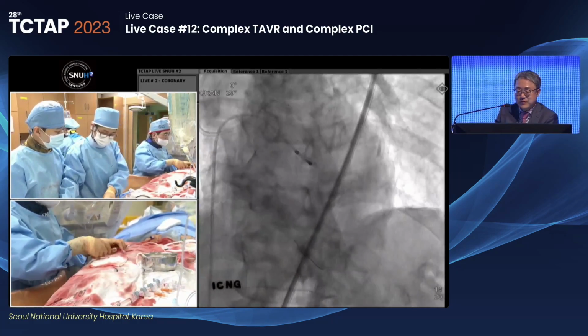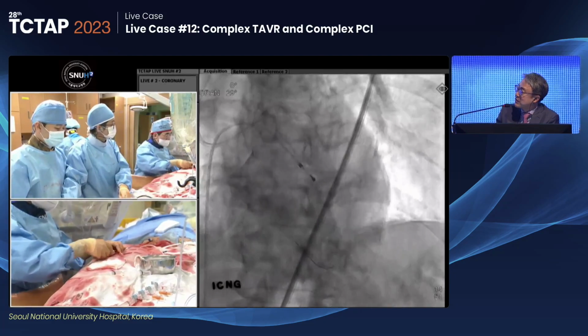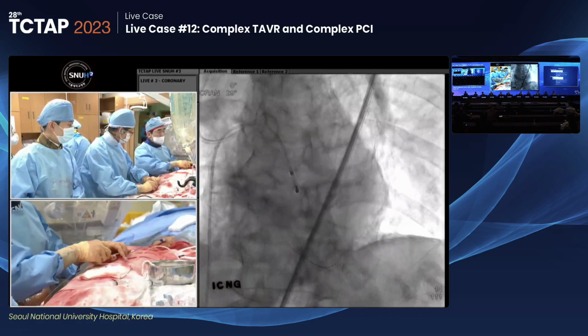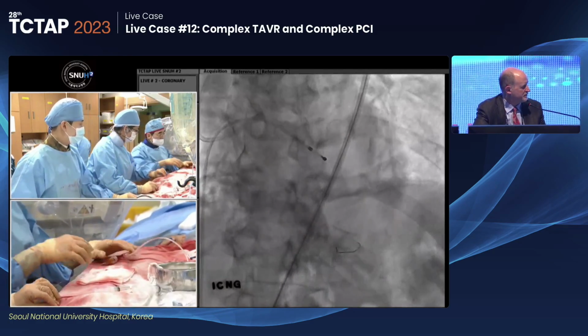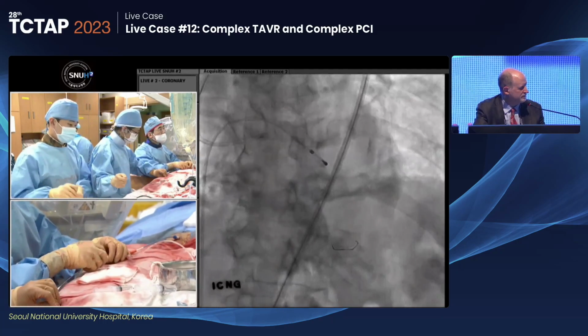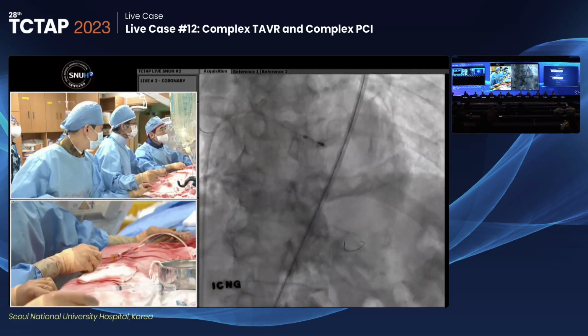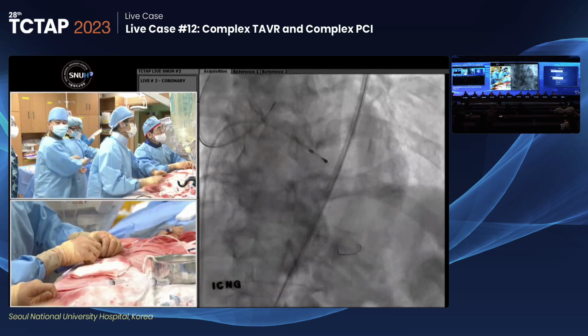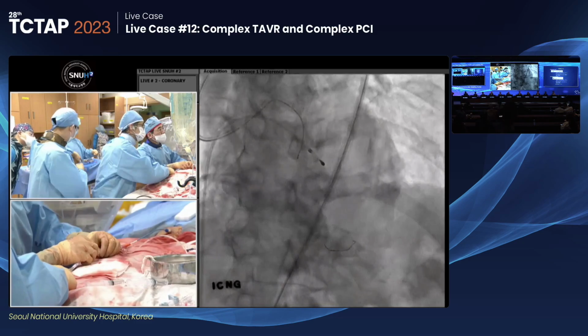It still won't go down. Shockwave is a little more difficult to deliver than an NC balloon. It delivers okay, but it's a little tougher than even an NC, and it doesn't come this small. That is not the holy grail. You still have to atherectomize this, but then you might still need shock even after. Yes, it's the so-called rotoshock.